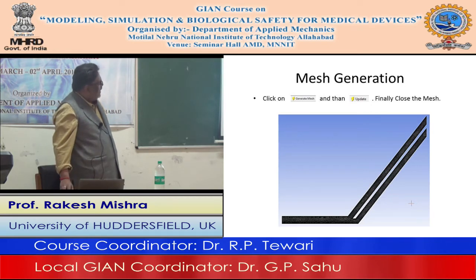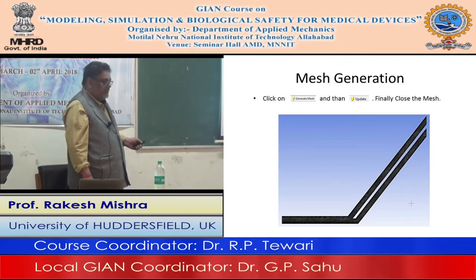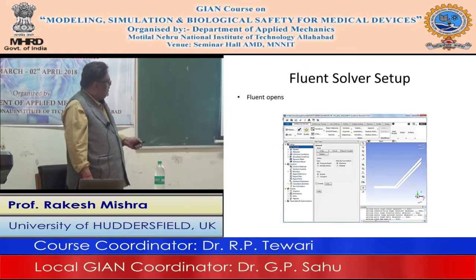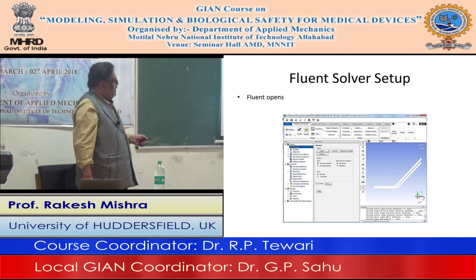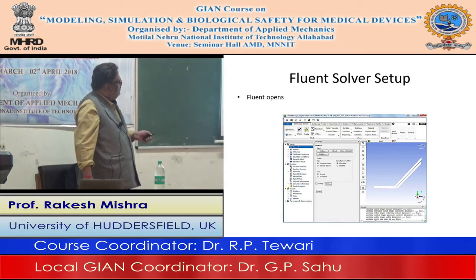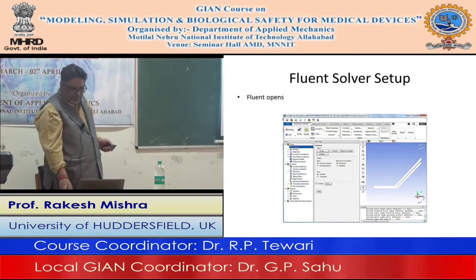So Fluent will open, and now we have to define the model conditions. As I discussed with you yesterday, we are initially running with a steady state model, because this is steady state with constant pressure at the inlet. Later on we'll make it transient, and I'll show you how to do that. So once we have done this, then we have pressure based solver, and velocity formulation is absolute. There is no relative movement here. So that is what the general model is.